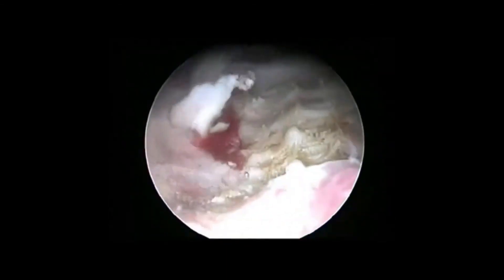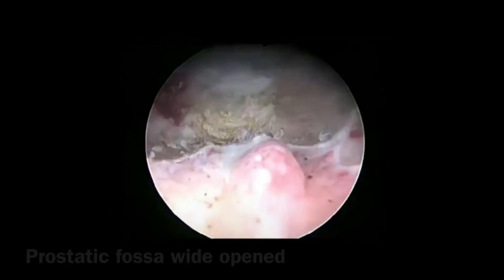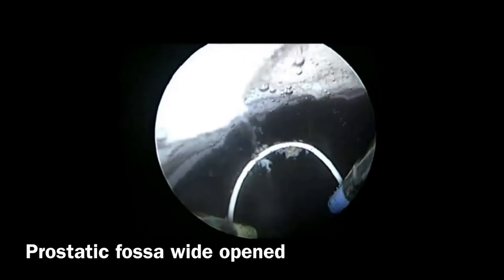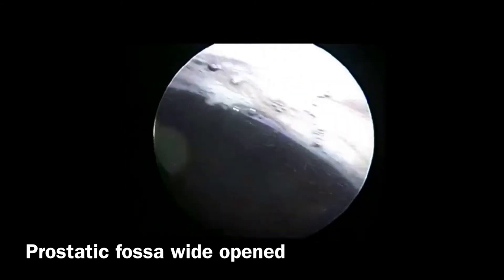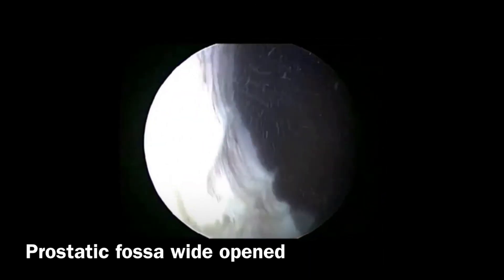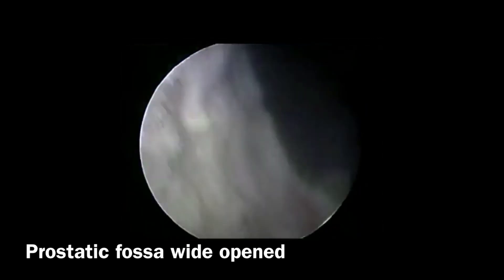As the resection is getting completed, one can make out that the prostatic fossa is wide open and the channel is wide enough to provide an adequate urinary stream. Any bleeding points are coagulated. Once the procedure is done, we evacuate the prostatic bits by using an Ellik evacuator and a Foley catheter is placed for about 48 hours. This is a wide open prostatic fossa and this completes the procedure.